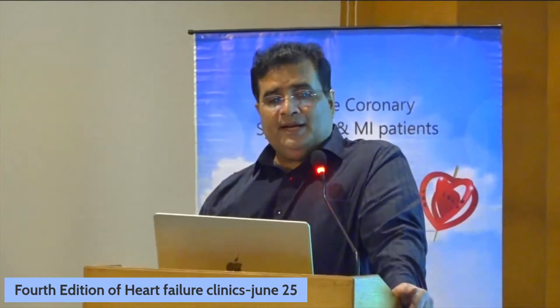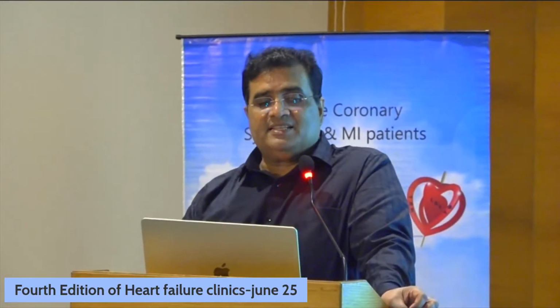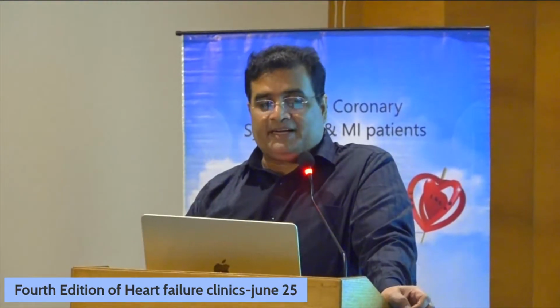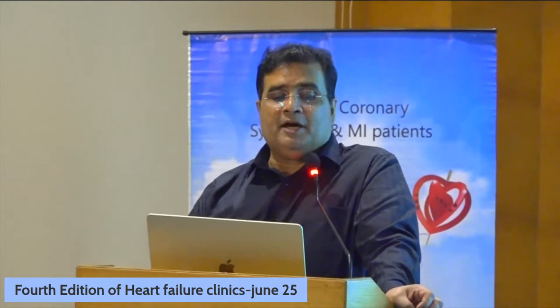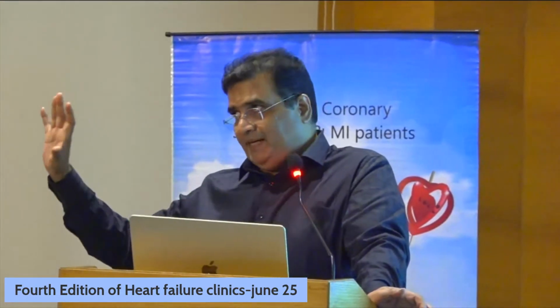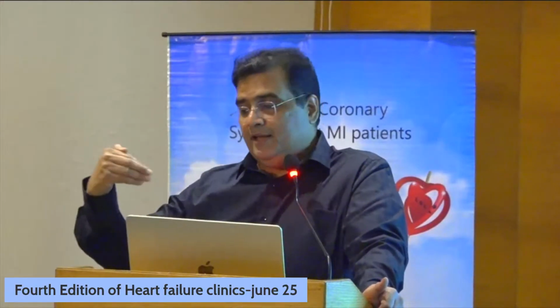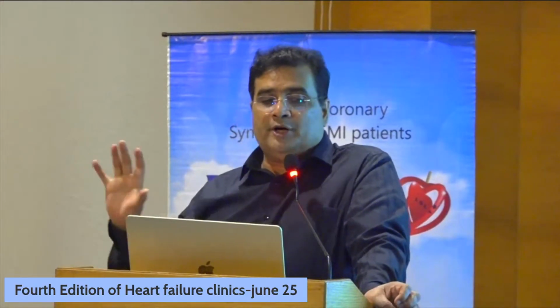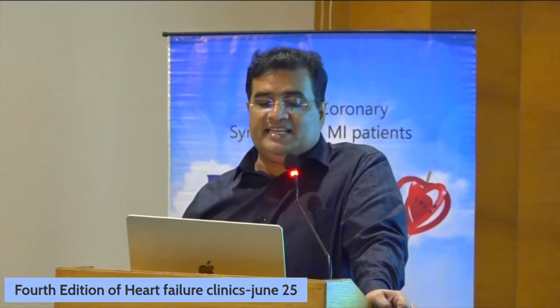Now, let us look at ischemic cardiomyopathy. Stress thallium SPECT is useful for epicardial coronary artery disease detection. SPECT is with a gamma camera, PET is with a CT scan. Because they are very closely mimicking names, I just wanted to clarify them. SPECT is with gamma, and PET is with the CT scan.